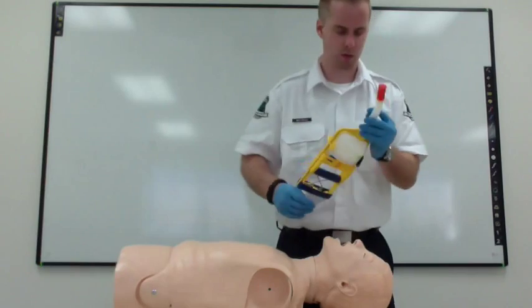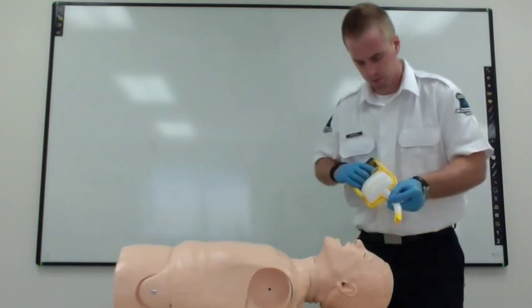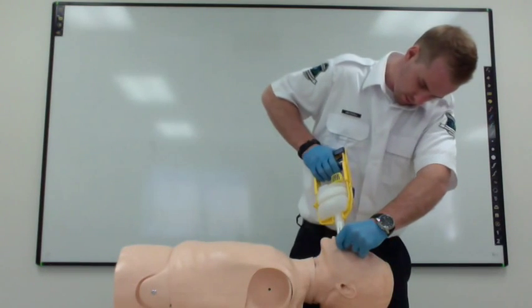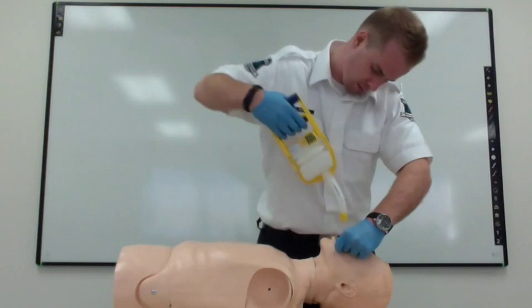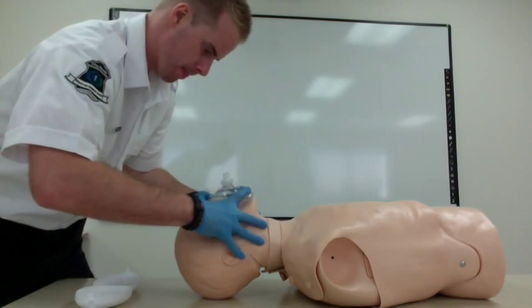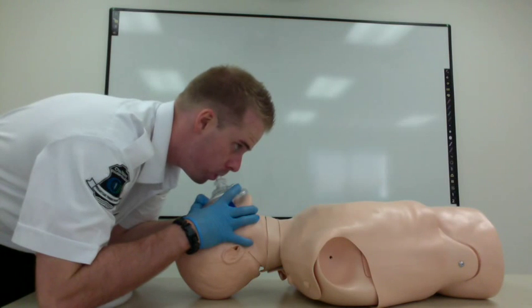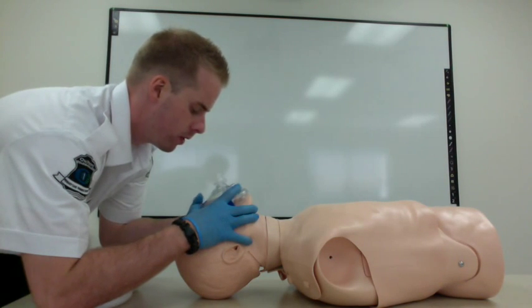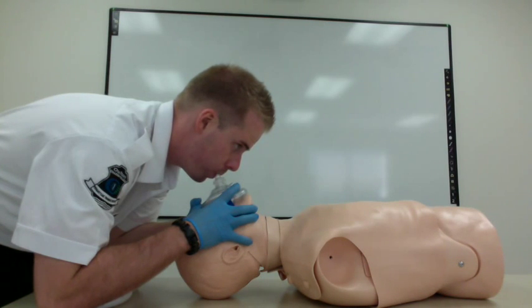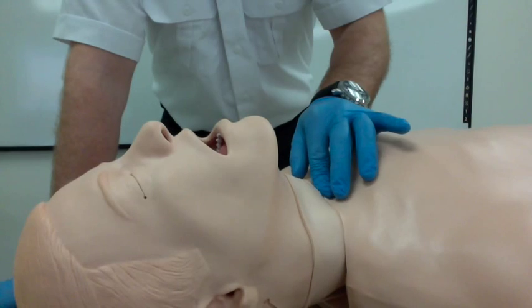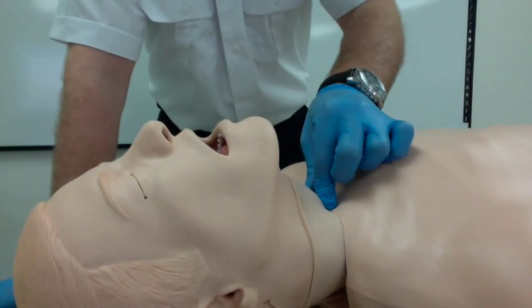Measure the tip of the device from the corner of the mouth to the tragus. Then, using a cross-finger technique, open the patient's mouth. Suction the oropharynx for 10 to 15 seconds. Using both hands, use a standard CE grip to seal the mask to the patient's face. Deliver a ventilation over one second. For rescue breathing, repeat this process once every five seconds.